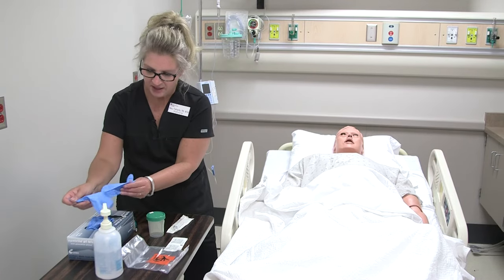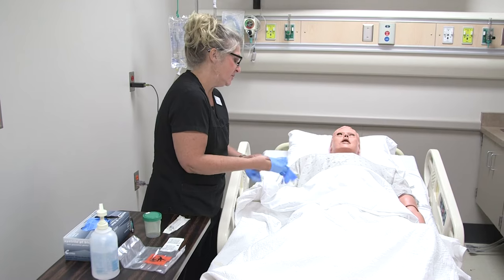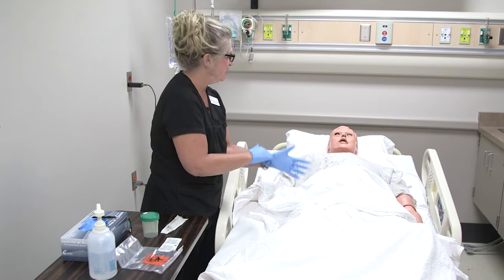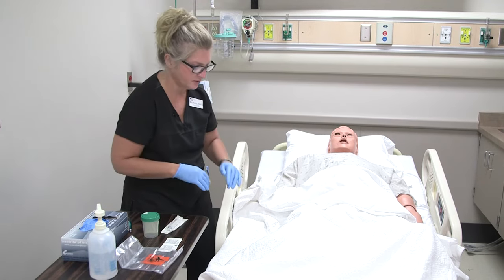Tim, I'm just going to go ahead and get a urine sample. I'm just going to take it from your Foley, from the tubing there, so you shouldn't have to do anything. I'll just get this done and we'll leave you alone, okay?